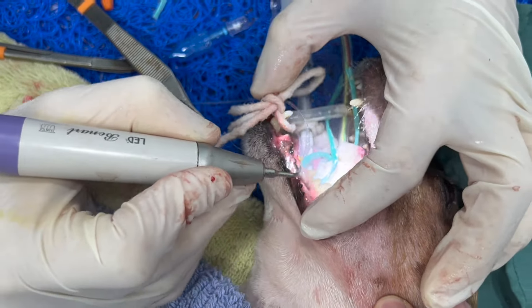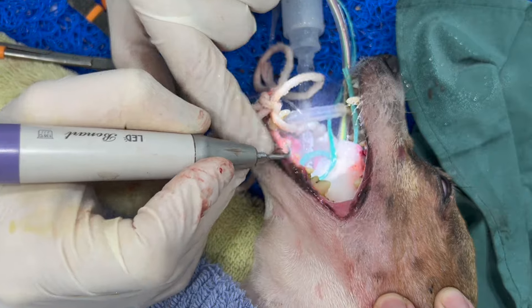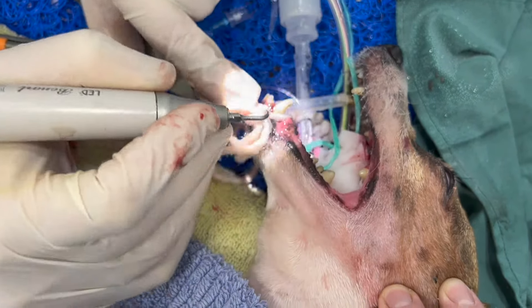Remember, I'm not trying to get a perfect mouth — I want a pain-free, infection-free mouth. On this first dental, I want to do as much as I can to improve this dog's oral cavity.